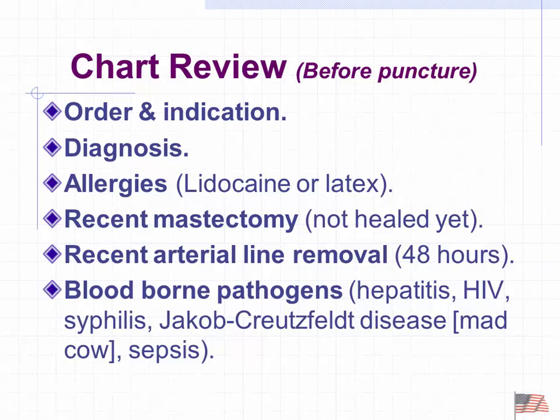Also, there should be some indication as far as why we're doing this. This is not a benign procedure. It is not something that I would just do at a whim. There should be a good indication for why we need this data, and also to see if there's not some non-invasive way that we can get the same information. Find out what the diagnosis is.